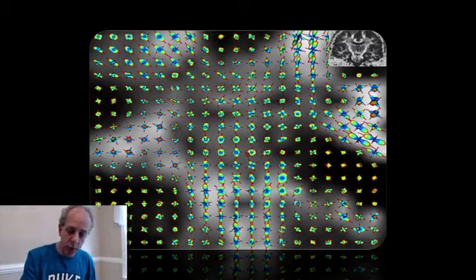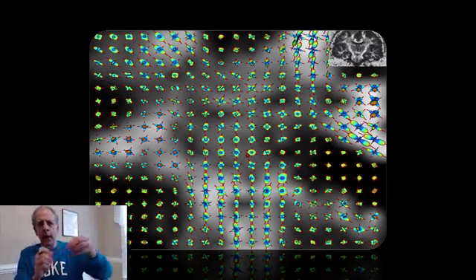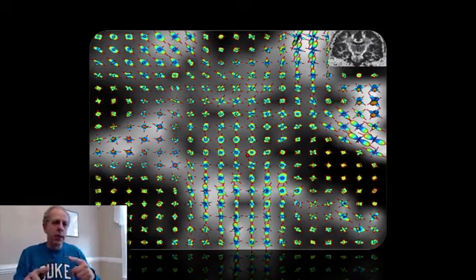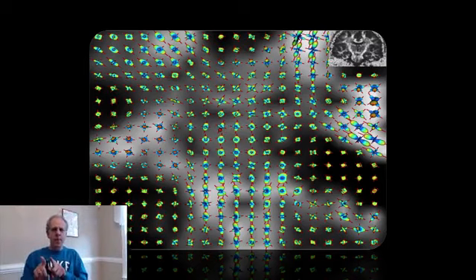So this I'm drawing here, the more round it is, the more isotropic, uniform the probability is, the more stretched it is, the more anisotropic in that direction. And if you see that there is a cross, then there is anisotropy in more than one direction. You can consider it completely, or as we see here with this red, we can just pick the maxima, where it's actually very strong. And that means that probably there are fibers, there are cables.